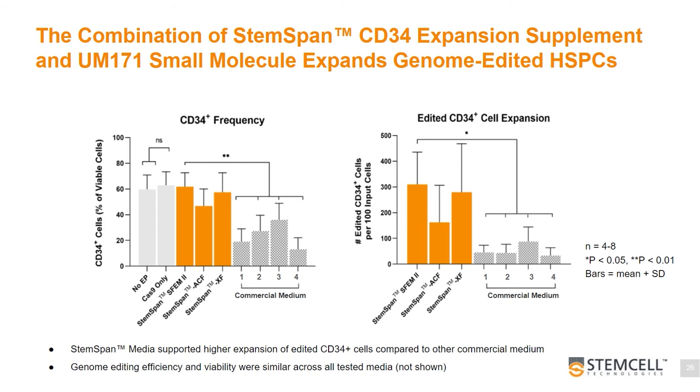Next, we focus on the identified optimal condition and characterized it in more detail. The graph here highlights that the combination of CD34 expansion supplement and UM171 maintain high frequency of CD34 cells across tested StemSpan media, as shown on the graph on the left, and importantly, these conditions support expansion of genome-edited CD34 cells, as shown on the graph on the right. We also tested the performance of other commercially available media, which is shown in the dotted bars here.